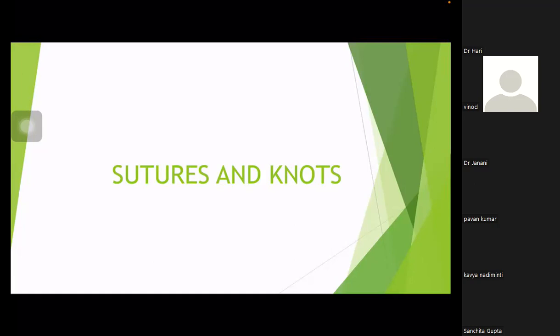For example, you have to know the half-life of the sutures and what you are actually using it for. When should you use absorbable, non-absorbable, or delayed absorbable sutures, all these things. I think the class will be a good learning point for Vinod, and also hopefully revision for the rest of you.